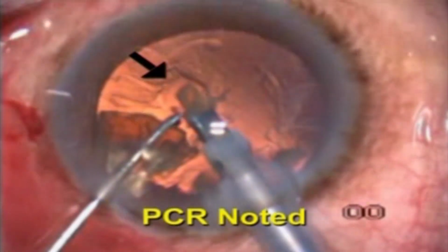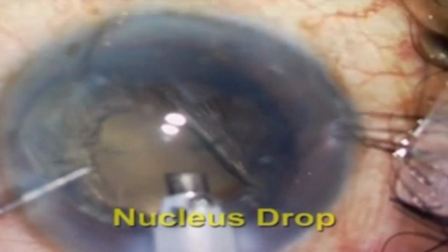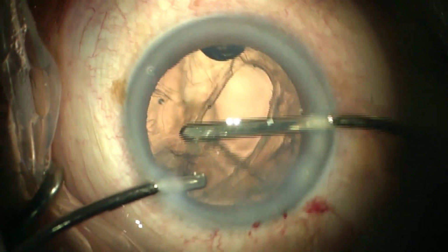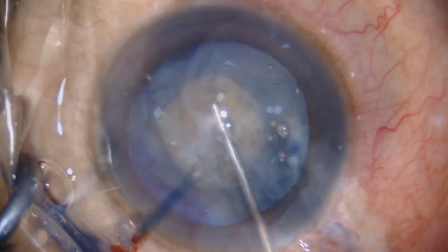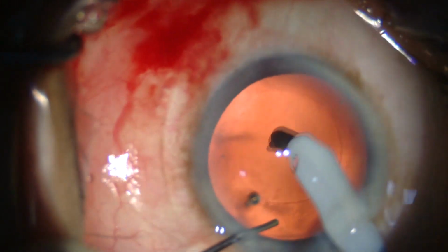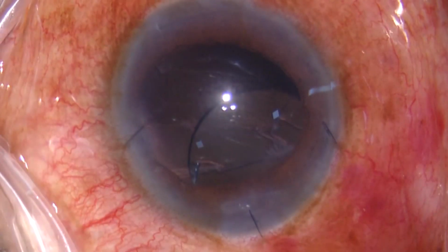Early recognition combined with advances in instrumentation have enabled effective management of PC rupture and vitreous loss during phacoemulsification. PC rupture can occur at any stage of phacoemulsification. For example, during hydrodissection, nucleus removal, cortex removal, posterior capsule vacuuming, and during IOL implantation as well.